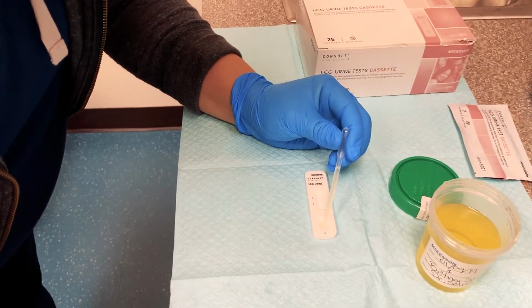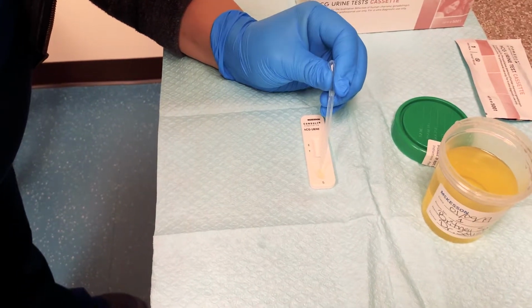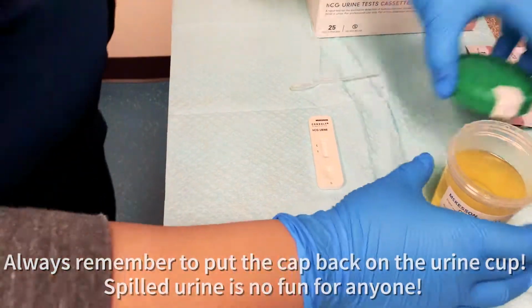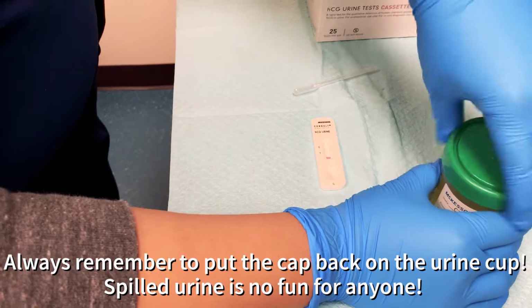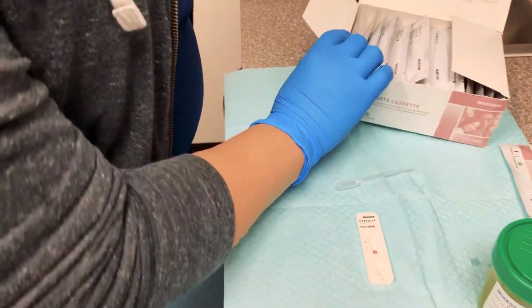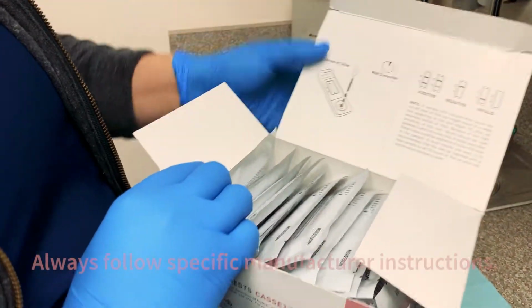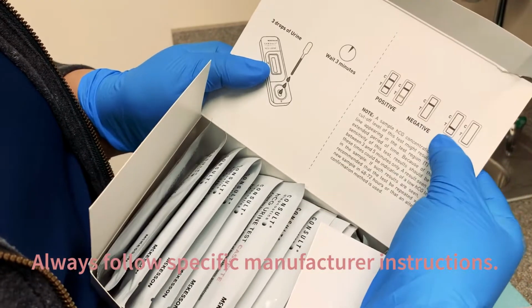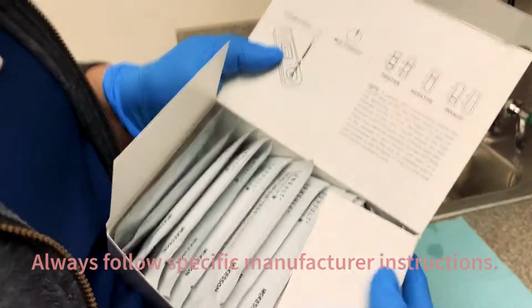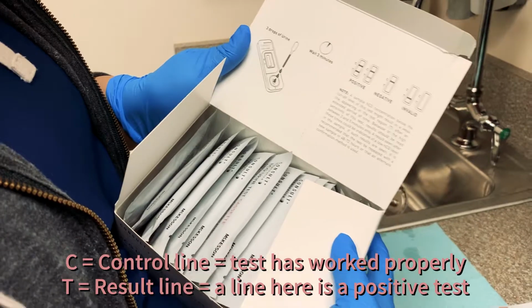And then all of it in here, and it's going to absorb it. And then all these little boxes with the hCG test, it has little instructions. So 2 lines is a positive, 1 line is a negative. Where the C is, where the T is invalid. And then it's a total wait time of 3 minutes for this specific pregnancy test.